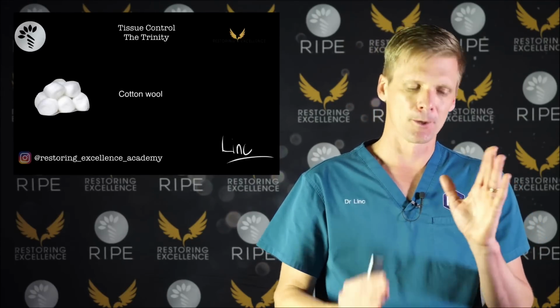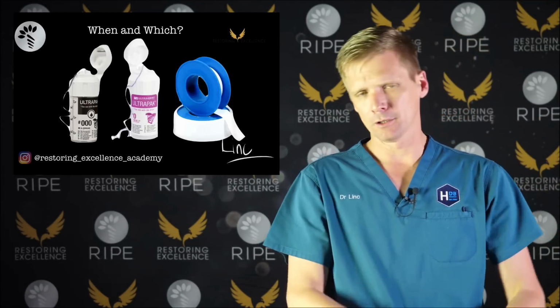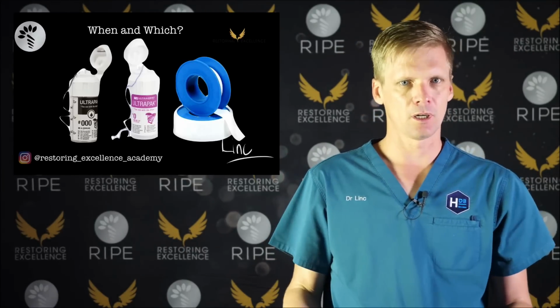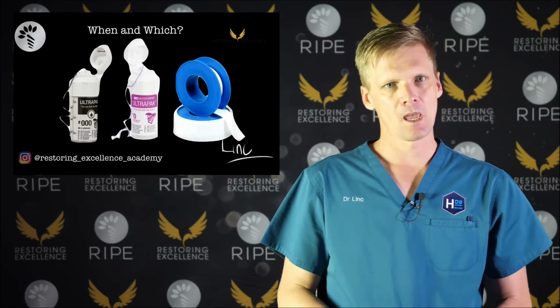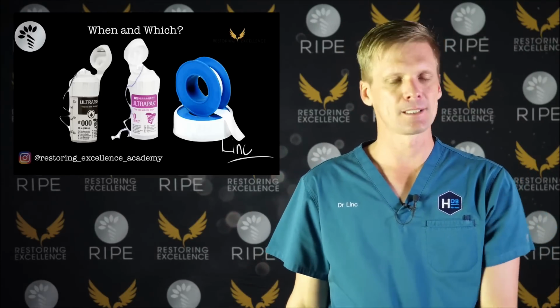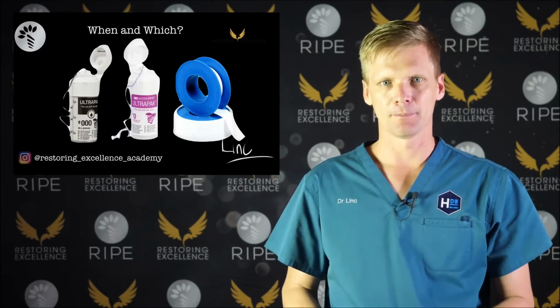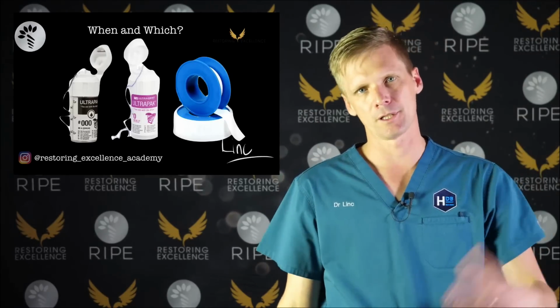It's the same with all of them. When I'm using cord or cotton or Teflon or any of these things, just so that I can place the core so that it's not a bloodbath, that's tissue control, and they all take time. All of them take time. So at least 5 minutes, and if it's a bloodbath, you need 10. Now you need to go and do something. If your office has many hygienists, go and do a hygiene check. If you don't have a hygienist to keep you busy, go and play on Facebook for 5 or 10 minutes. Do something, because if you sit there, you'll be tempted to have a look, and as soon as you pull it out too soon, it's going to bleed and you've got to start again.